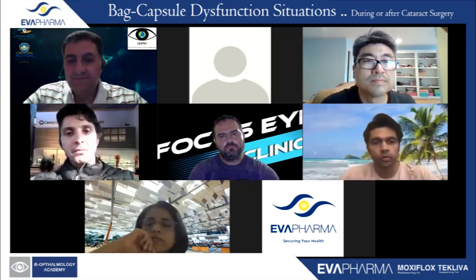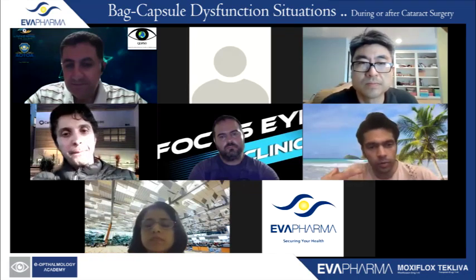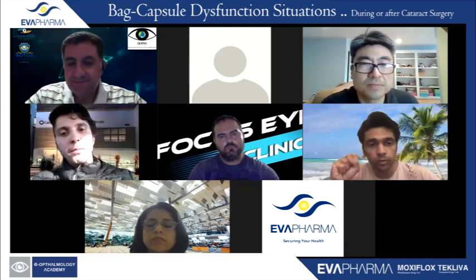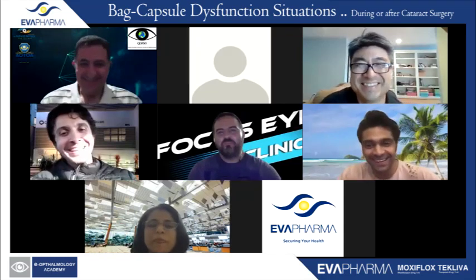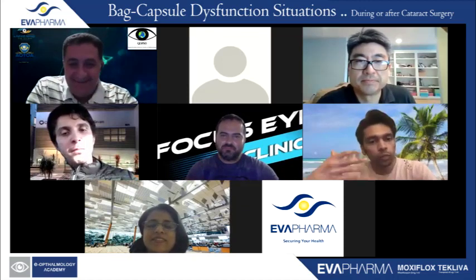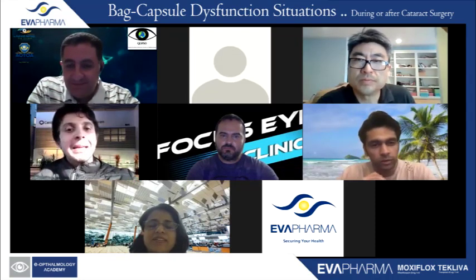Oh, the first case you showed where you placed an air bubble below the lens, below the microspherophakic lens, I saw Lukan's face go, "Whoa, what's happening?" So I was just asking, more from a safety aspect, what is your take on the air bubble? Have you seen what results have been like in those scenarios where you place an air bubble?